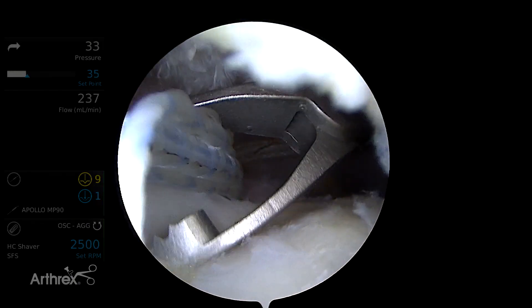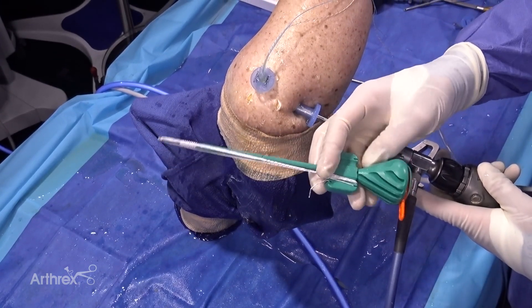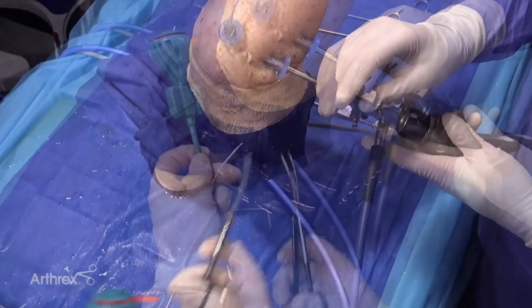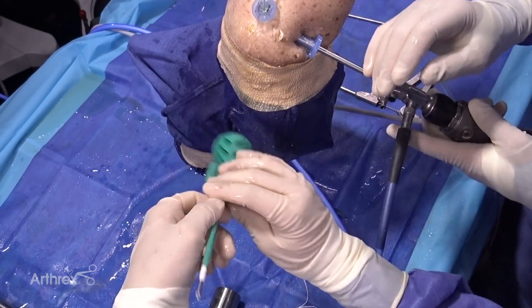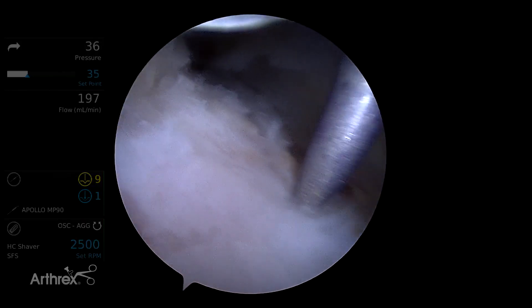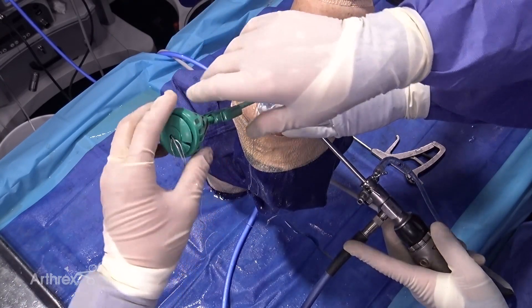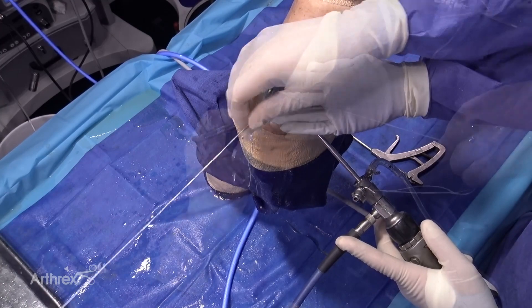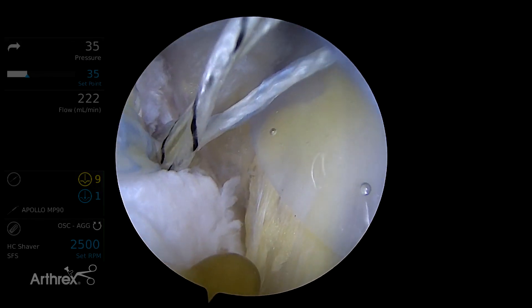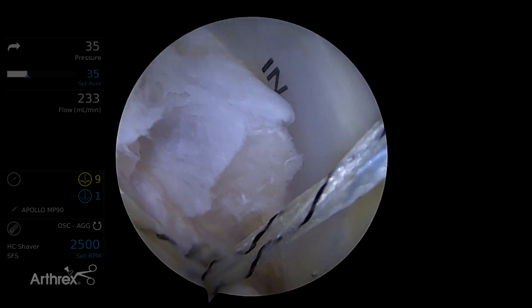For the anterior dog ear I'm going to want to use the knotless mechanism to reduce the dog ear and we're not going to need the tape. We have this knotless swivel lock but we're going to cut the tape out of there and then just pull it out from the eyelet. So we still have our knotless mechanism which comes up through the cannulation of that inserter. We'll externally rotate some, then take this driver off and have our knotless suture mechanism still in place. We're going to cut these two tapes. Now we've just got the knotless mechanism sutures left — the working suture which is blue and white, and the passing suture which is black and white — so it's looking more like the knotless suture tech configuration we're used to.